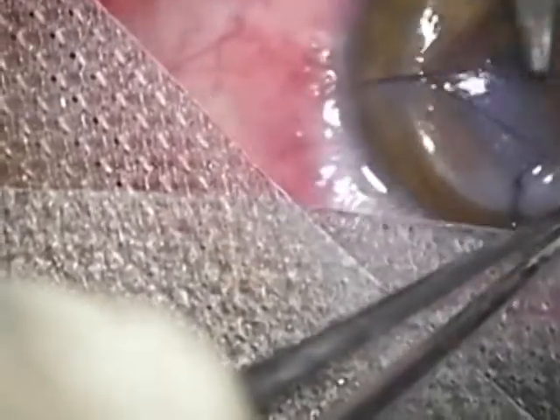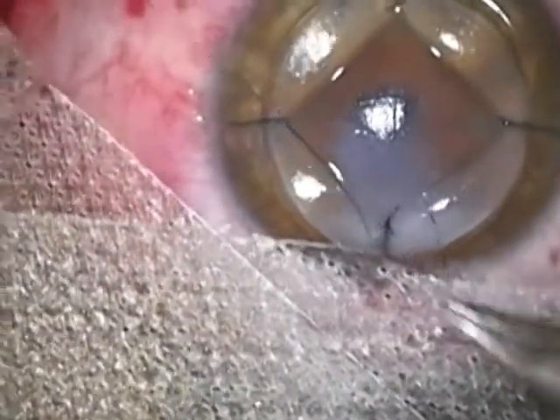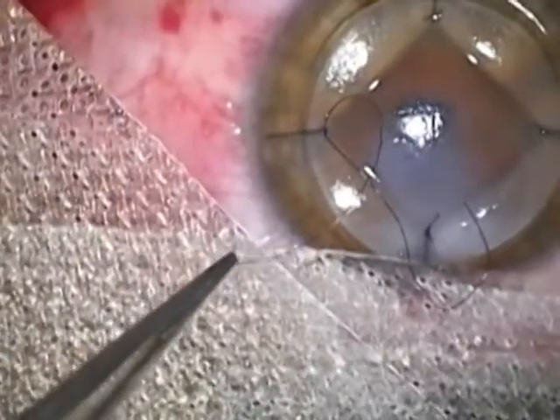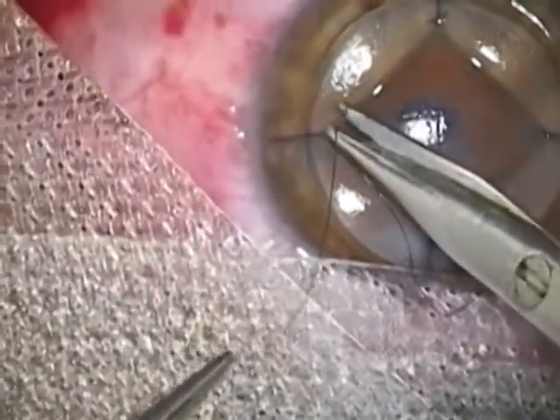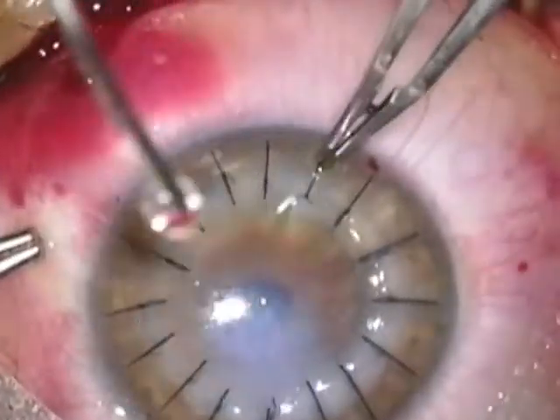With this hybrid technique, we aim to make it possible for any corneal surgeon to reproduce the technique that we believe is currently best suited to solve corneal ectasias, with a good final visual acuity and decreasing the risks and the rate of complications.